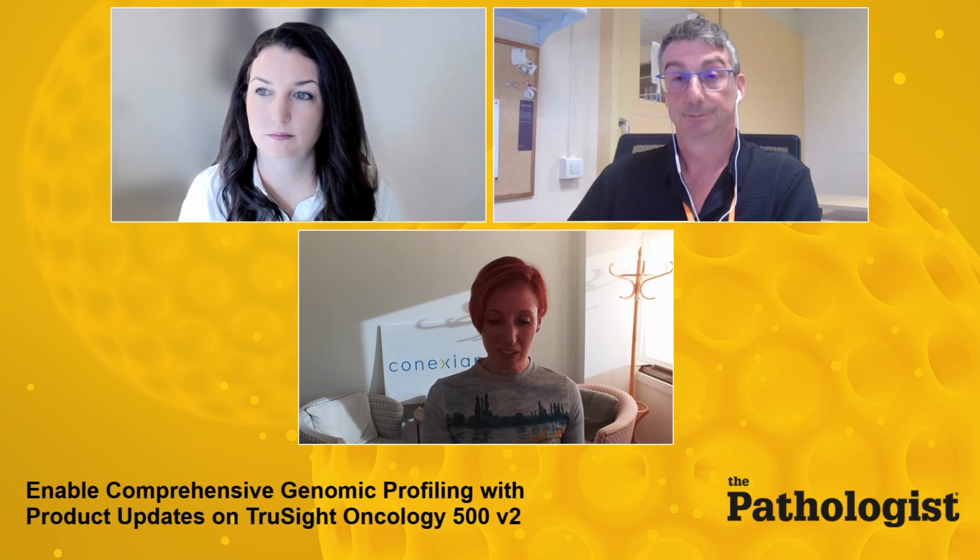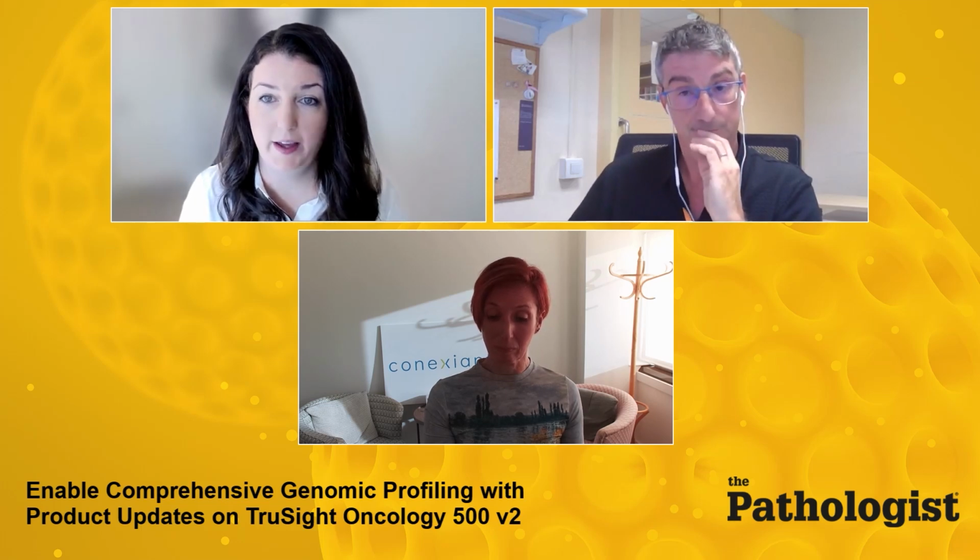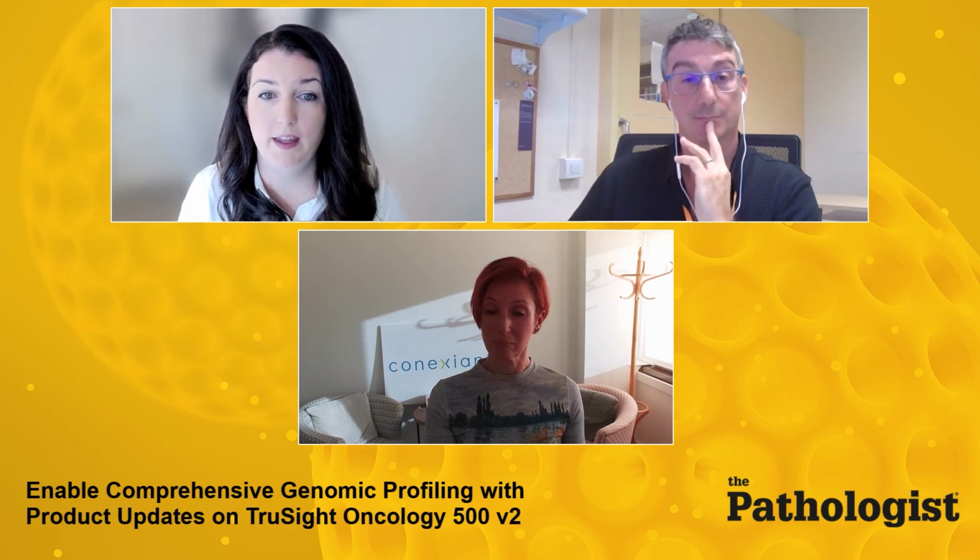Heather, is the TSO 500 version 2 compatible with the NextSeq 2000? Yes, it is compatible with the NextSeq 1000, 2000 platform with the P2, P3, and P4 flow cells.